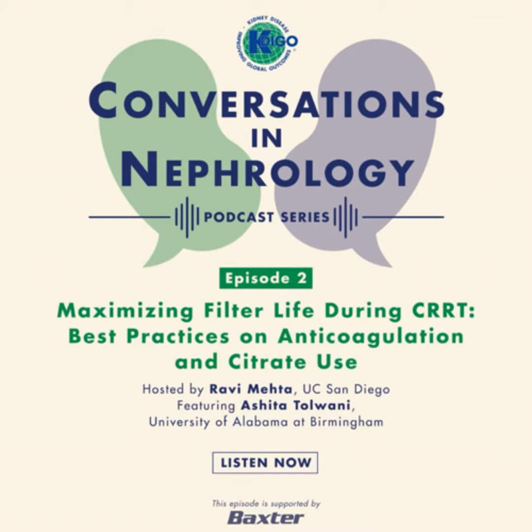So how we manage these challenges were all different ways. First of all, it's very important that we ensured a proper access in the right IJ. Many places, if they were using convective therapy, made sure they used higher blood flows to decrease the filtration fraction or even convert it to diffusive therapy. But I think what came out of this pandemic is a realization that these patients need anticoagulation. There really has not been a single anticoagulant regimen that has been shown to be better for these COVID patients, and people have tried all different things, anything from regional citrate anticoagulation to systemic heparin to thrombin inhibitors.